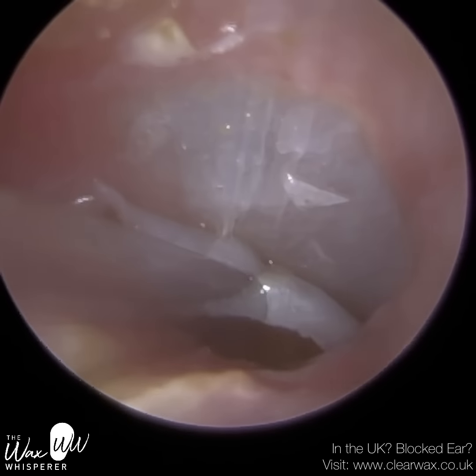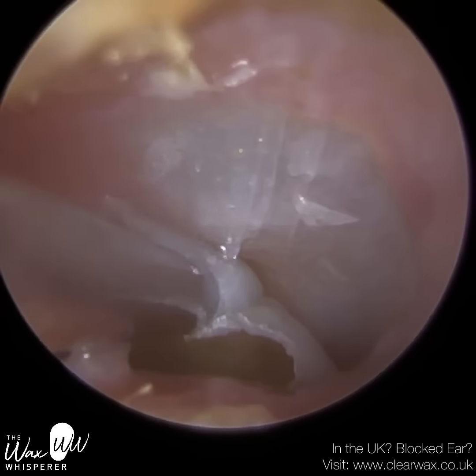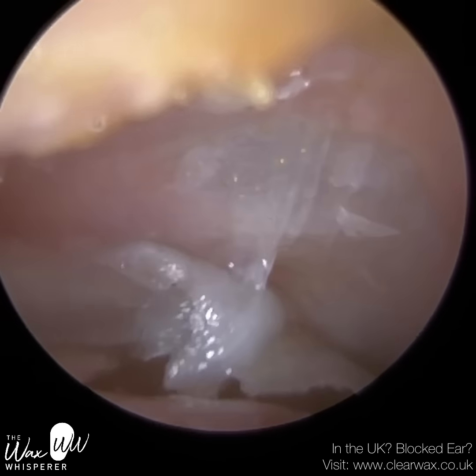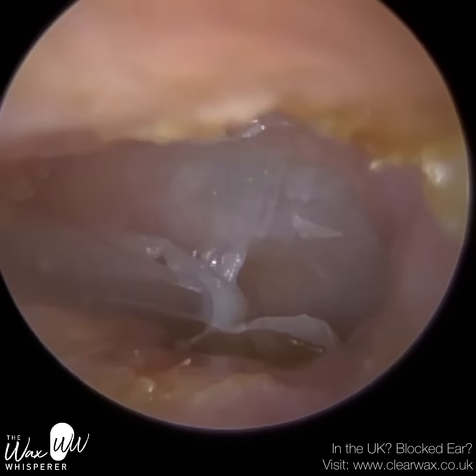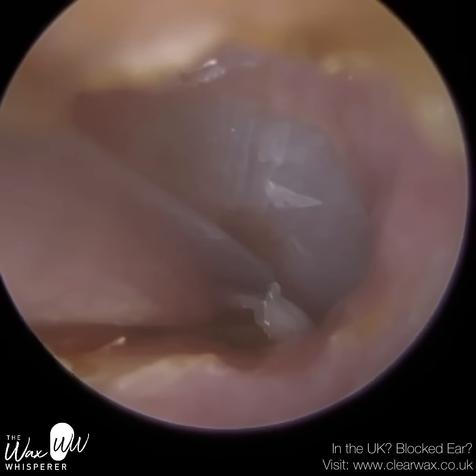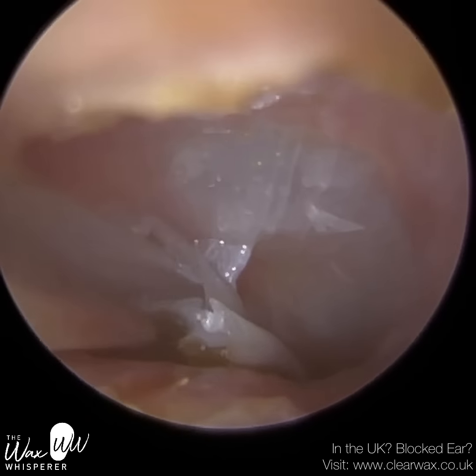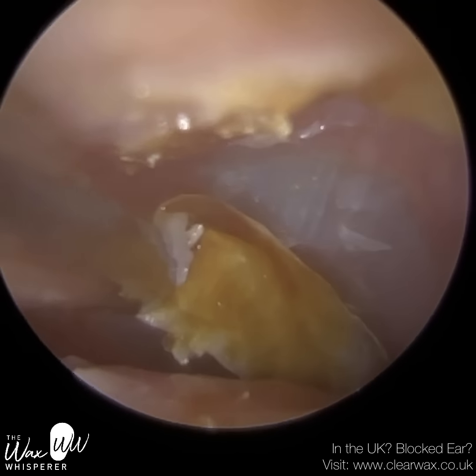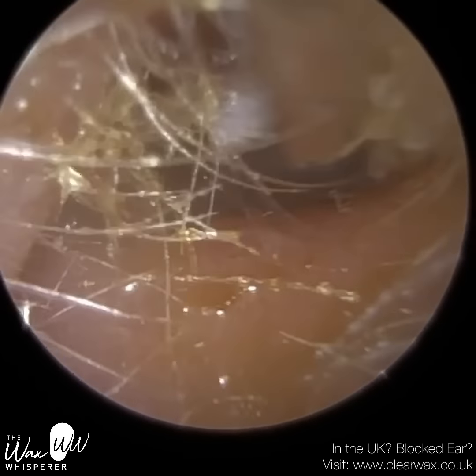So the skin's dying off the eardrum. Instead of coming away from the eardrum completely and attaching itself to the ear canal and then eventually coming out of the ear, it's just folding upon itself. Almost like if you have a lasagna sheet that's softened and you lay it and you fold it upon itself again. Or if you're icing a cake and you're kind of making folds on top of the previous layer. That's how it's going on with the skin here.